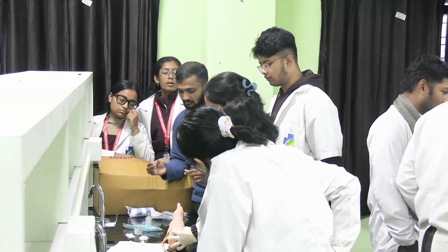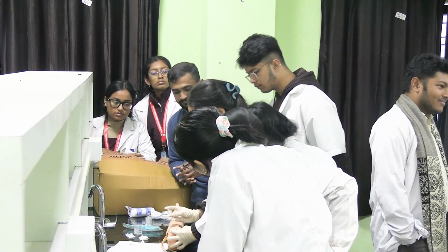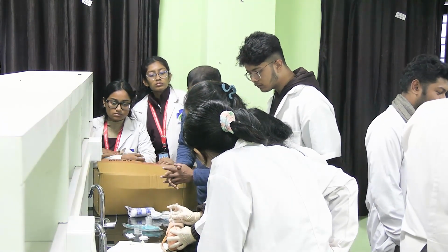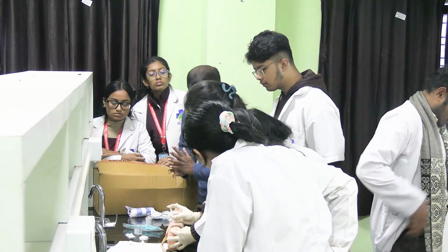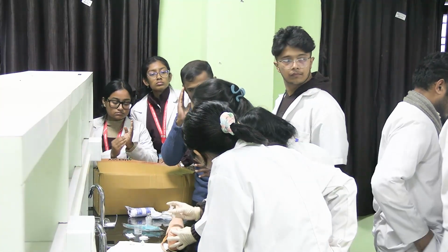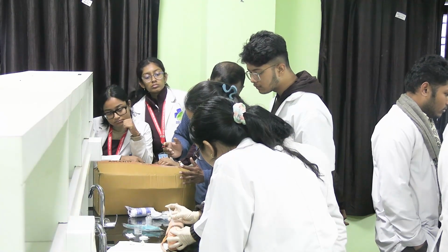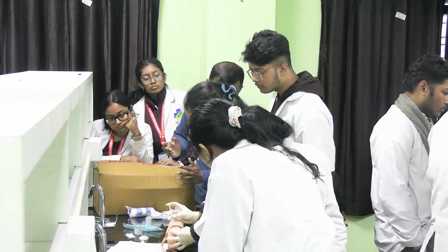Okay, fine. So now how will you insert it? What is the angle? 45 degree. This is 45. Yes, sir. So half of 90. Think in your mind, half of 90. Okay, a little bit more. Insert it.